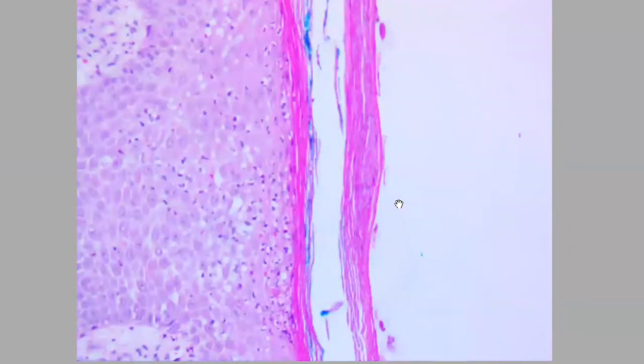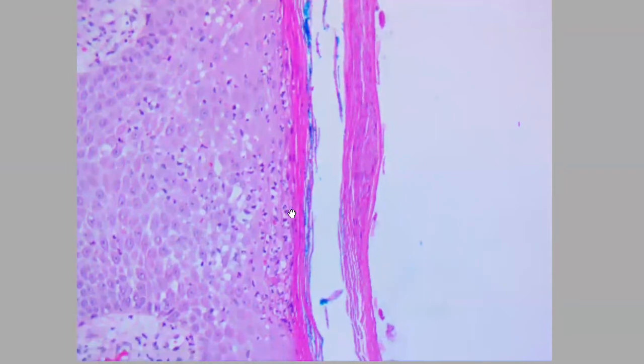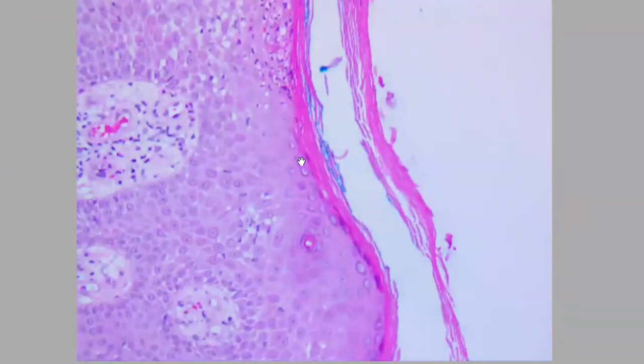So I'm here at the same area, and just to mention some key features again on higher power. So this is parakeratosis. These are keratinocytes. They are retaining their nuclei, as we can see these blue dots. And we can see here some neutrophils or many neutrophils, and some of them form these microabscesses, which we call the Munro's sign. And in the same area here, I will just move a bit. This is the granular layer. It's more evident in this area, and then it will disappear in this affected area.